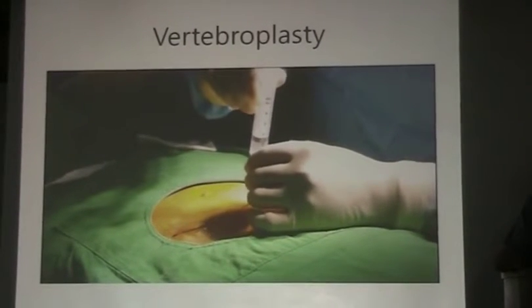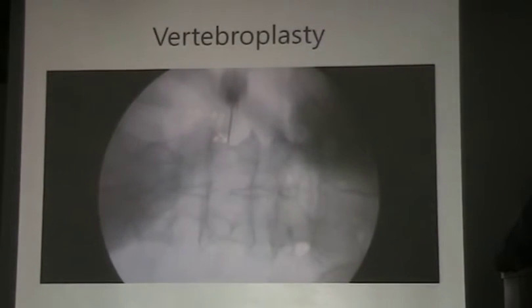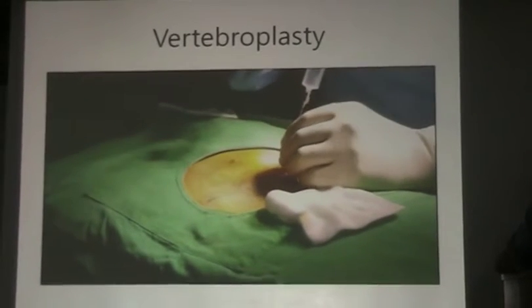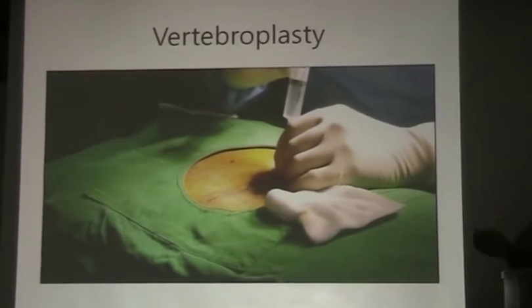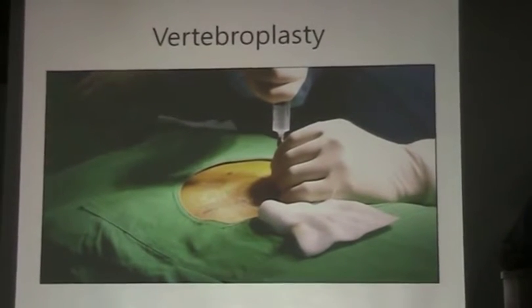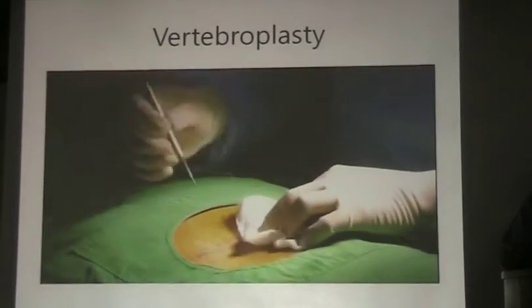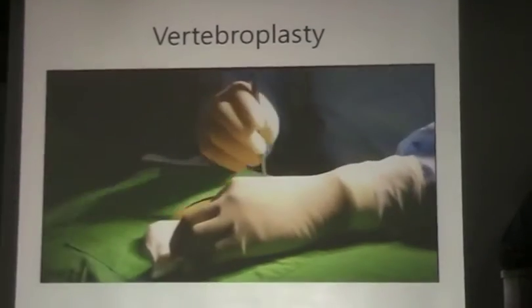Local anesthesia for the skin and muscle. And with the 20 gauge spinal needle, pedicle block. Pedicle block with 20 gauge spinal needle. Pedicle block is very important to do vertebroplasty. Just only under local anesthesia. Just a small skin incision.